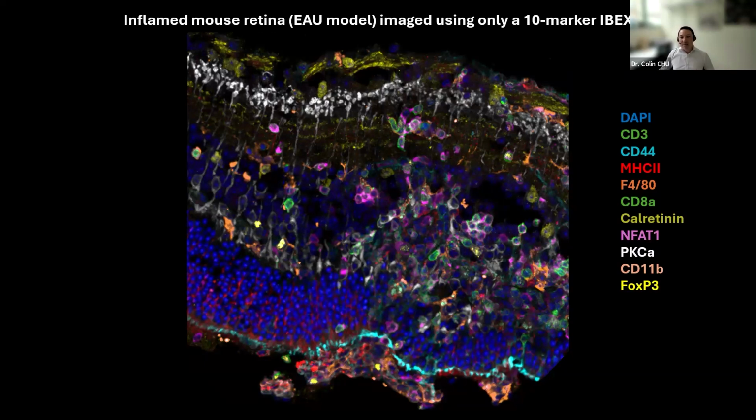But what I've shown you up to this point was all done manually. And so part of the time when I was in NIH, we were looking at ways of increasing the throughput, the efficiency, because, for example, doing it manually, we're taking the slide on and off the microscopes, manually staining and bleaching. There's problems there then with both realignment, but also the sheer amount of time and hands-on time, we call it, as researchers that we're having to put in to generating these data sets.